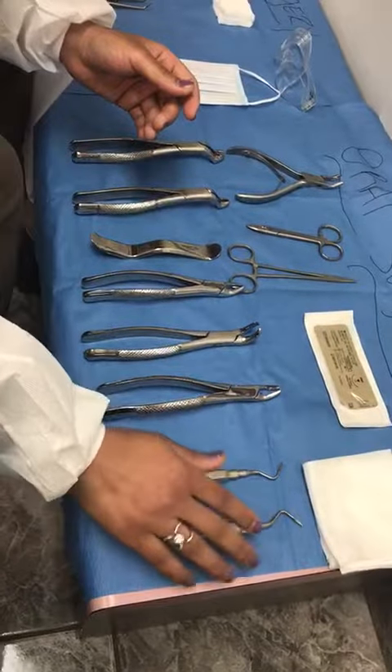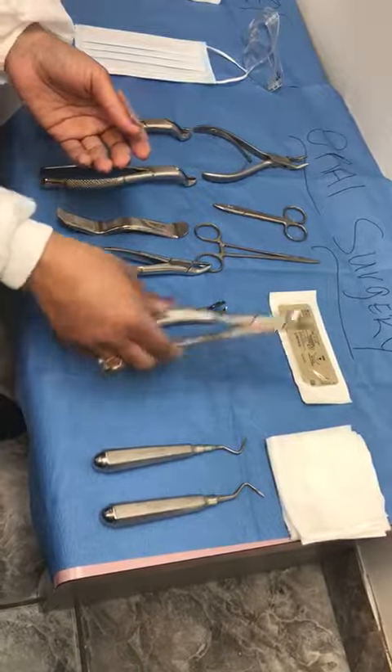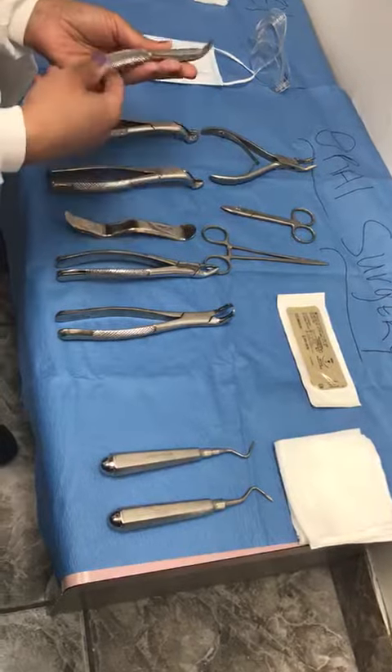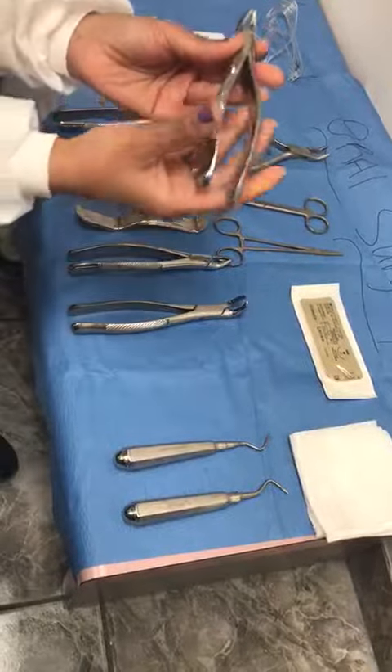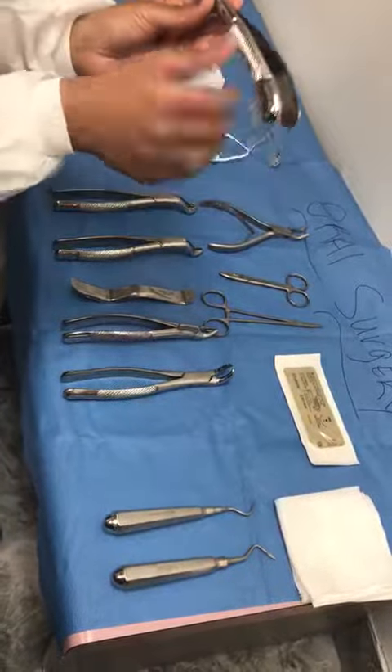Now we're going over the forcep. This is the forcep used for anterior teeth — we call this a 150, because forceps are often known by numbers. The ones used for maxillary teeth have an S-shape.